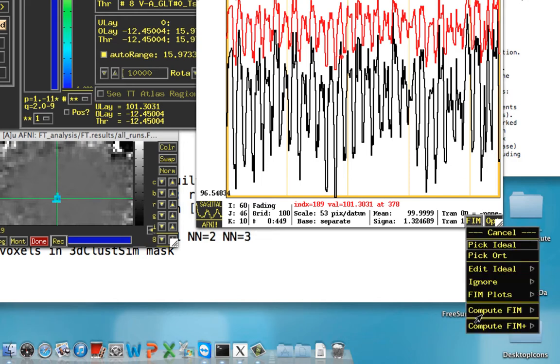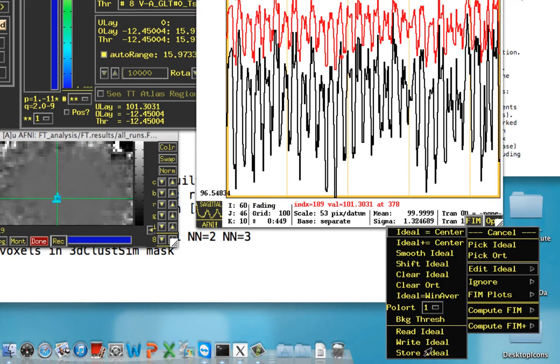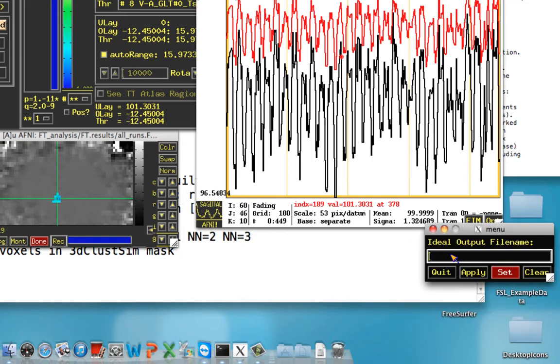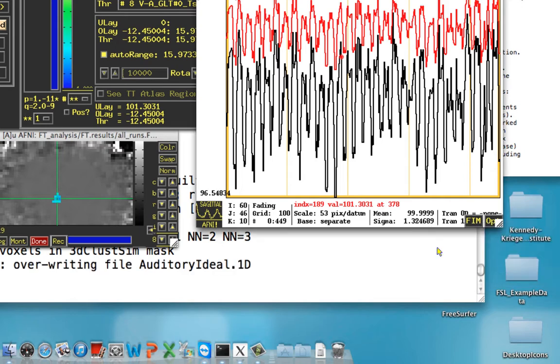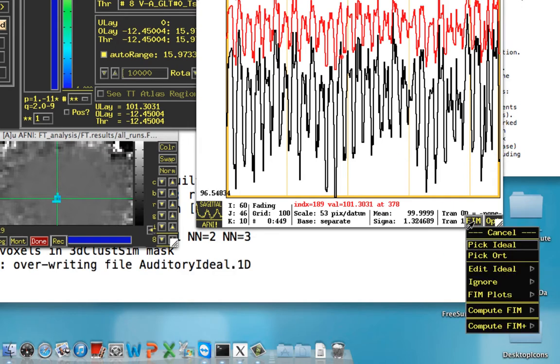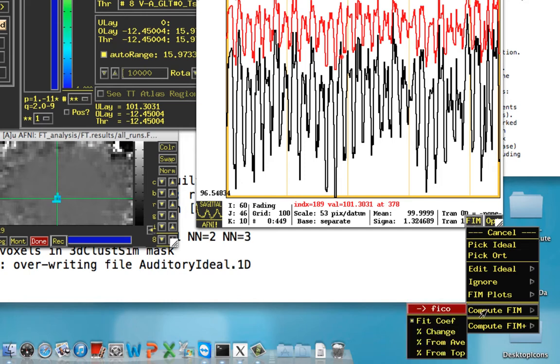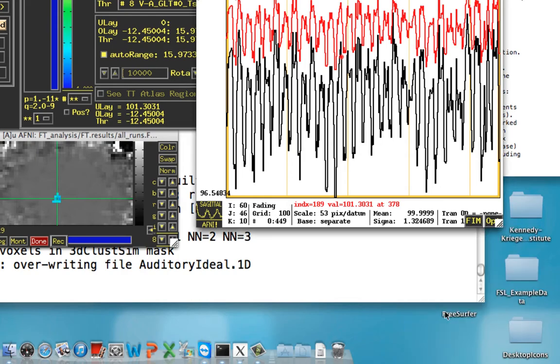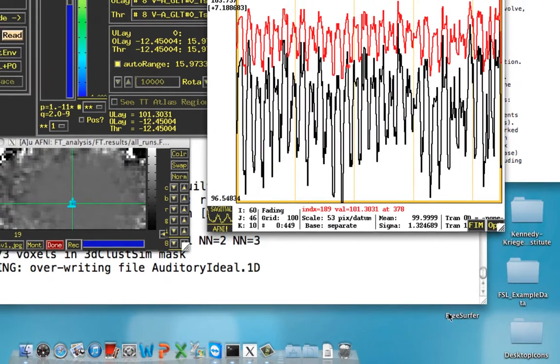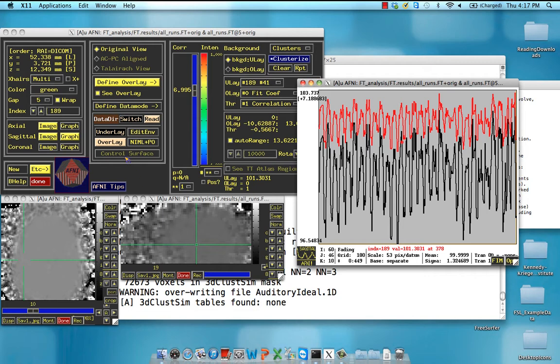Then click on FIM, and Edit Ideal, and then write this ideal out. So let's call this Auditory Ideal.1D. Not strictly necessary, but it just outputs what that ideal time course is into a text file. And lastly, if we want to compute this on the fly, click on Compute FIM and Functional Intensity Correlation Analysis. So click on that. It's going to generate a temporary dataset that's been loaded into memory.